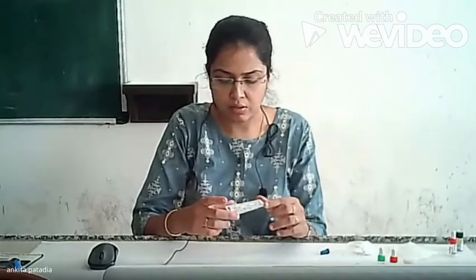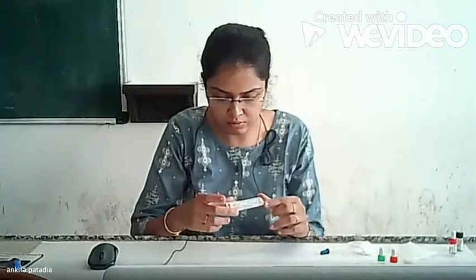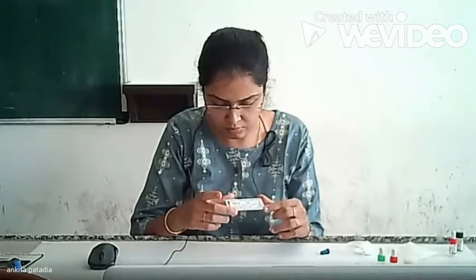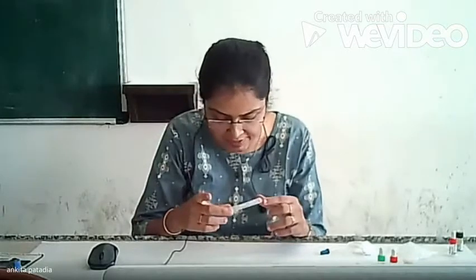Now mix it by rotation like this up to 8 minutes, or before 8 minutes if you observe the clumpings or precipitates or floccules, then you can proceed for the further. See, floccules have developed in positive control as well as in test. So our test is positive.